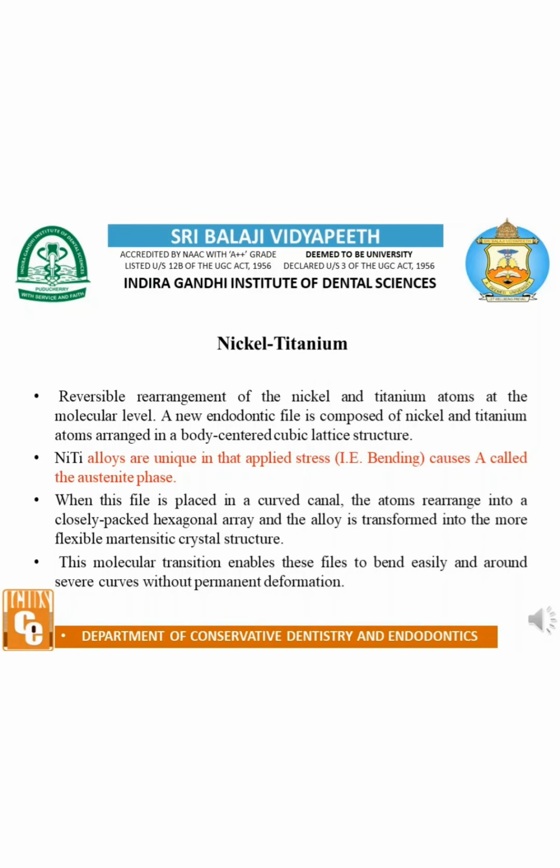Nickel titanium. Reversible rearrangement of the nickel and titanium atoms at the molecular level. A new endodontic file is composed of nickel and titanium atoms arranged in a body-centered cubic lattice structure called the austenite phase. Nickel titanium alloys are unique in that applied stress causes a transformation.